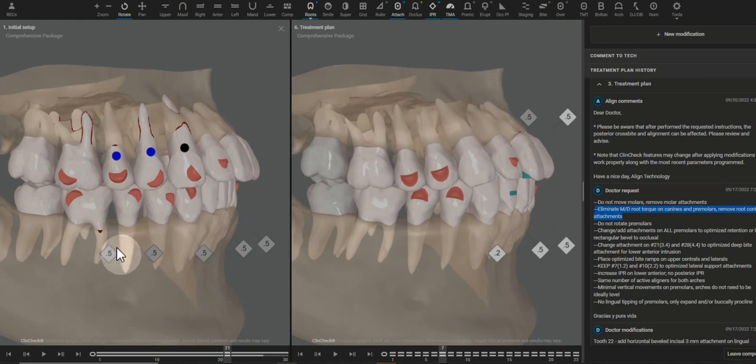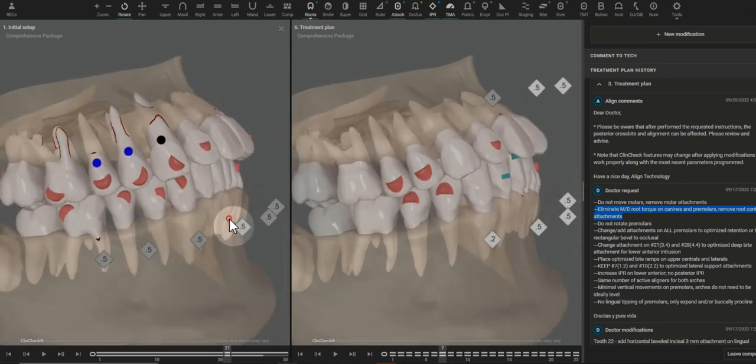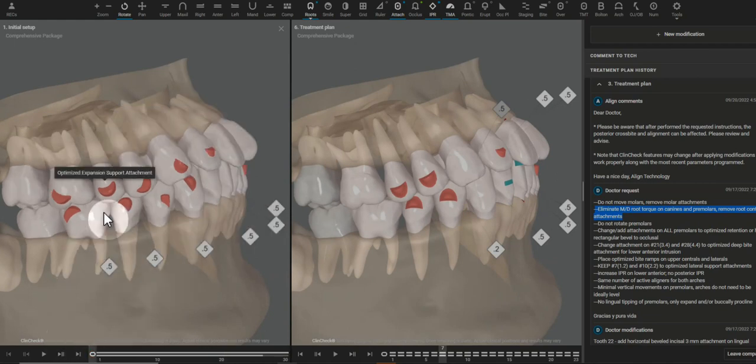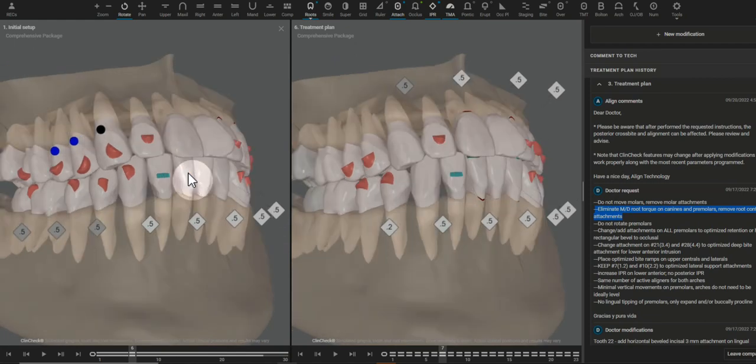I also wanted to eliminate this posterior IPR. There is definitely some IPR that's going to be needed because of how thin this buccal plate is for upper and lower, but posterior IPR has a high risk of posterior open bite by allowing the molars to then tip mesial instead of the anterior retraction that you're desiring.